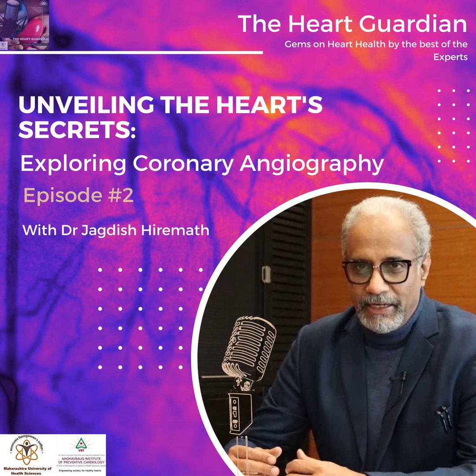Artery of the wrist, the radial artery, or the groin, the femoral artery, are just under the skin and can be felt pulsating. Either of these areas is made sterile by antiseptic solution. A local anesthetic is infiltrated, and a tiny needle pricks the artery and the blood spurts out. A cannula or a short tube is inserted in place in a fairly painless manner.